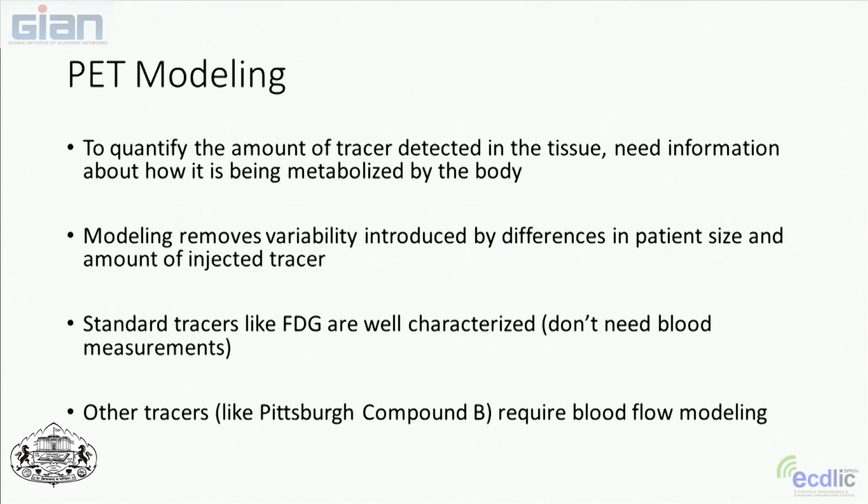If you know anything about collecting blood, you know that it's much harder to get arterial blood than venous blood. Venous blood is the blood coming back to the heart after it's gone through the body, whereas arterial blood is still being sent out to the tissue, so it's full of this tracer and full of the oxygen that's going to the tissue. To get arterial blood, you usually have to make a cut, and you want a deep blood vessel. So people in these research studies had to be taken down to the surgery department, where they would set up an arterial line before the PET studies.